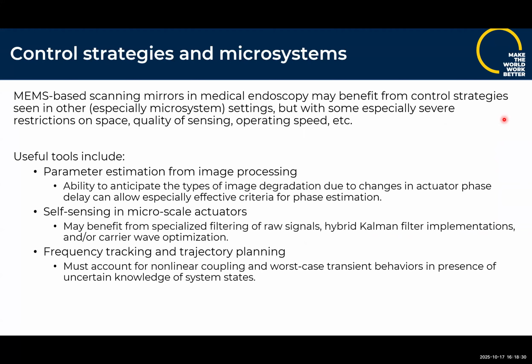So in summary, I think of this as introducing some controls techniques that show up in microsystems engineering, or in other fields where they can be adapted to microsystems imaging engineering, such as image-based feedback for parameter estimation, self-sensing schemes, and phase lock loop. And then there are different twists that come on them for the microendoscopy applications.